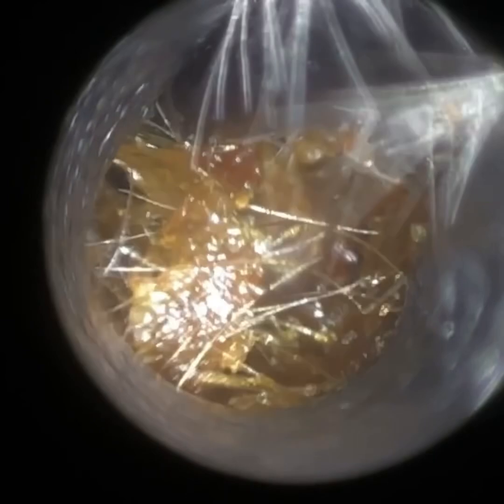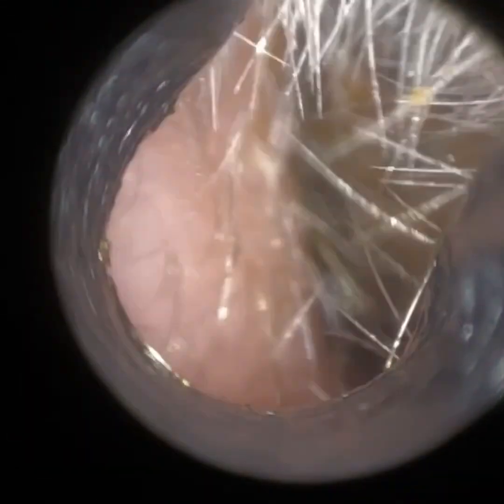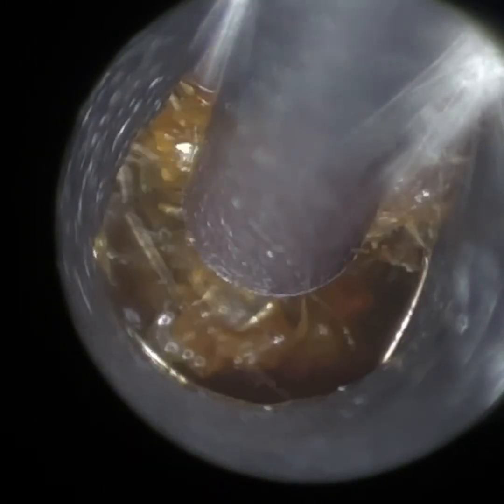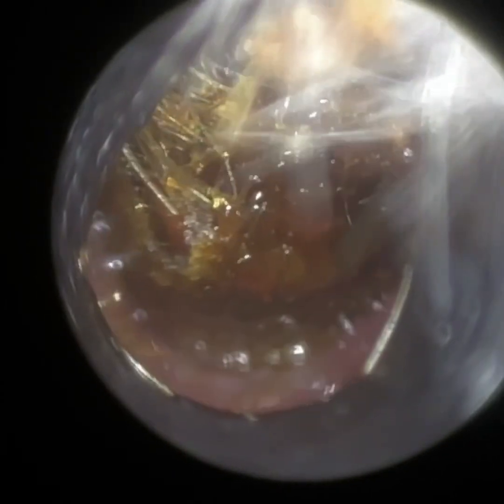They've got a very hairy ear, and we have to deal with that when we remove earwax as a clinical ear care specialist, so it can be challenging at times. In the worst case scenarios I've had to pluck some hairs out, but we didn't have to do that here. The specular itself helps to push some of the hairs away. I just went back in with the suction probe because this boulder of wax was a bit deeper in, and whenever the wax is deeper in, I always see if we can remove it with suction.